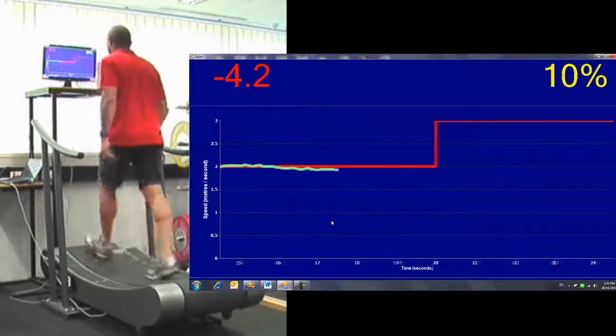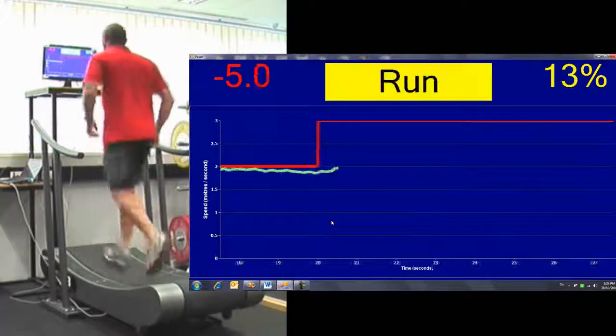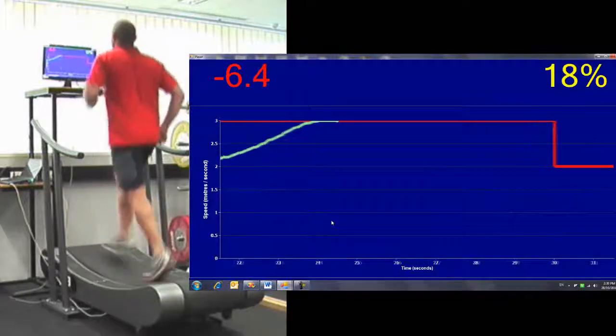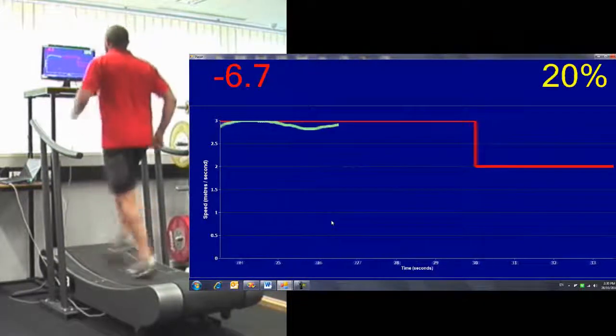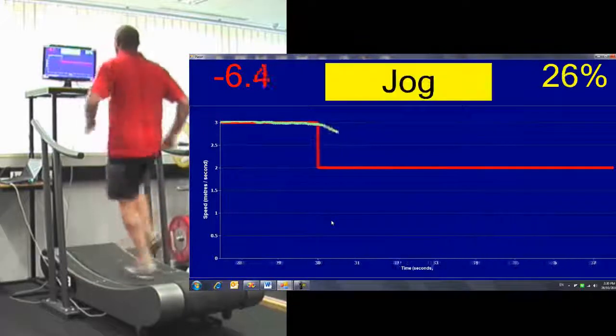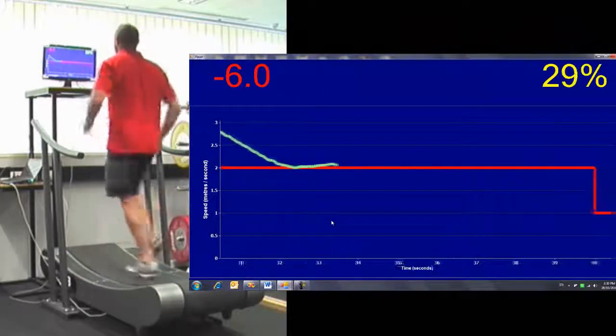In this image you can also see in the upper left corner of the screen the distance behind the target the athlete is currently at, and to the right of the screen the percentage of the trial that they are currently conducting.